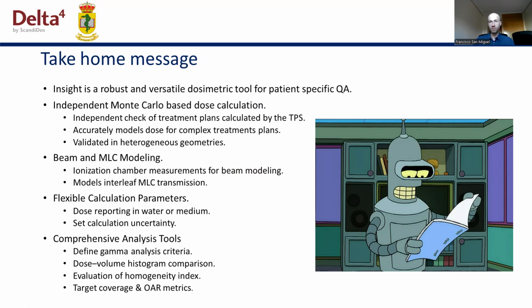Also, again, this is very important for us. Besides, although Insight does not perform fine modeling of the MLC behavior, it does model the interleaf transmission with good results, as we saw. As previously noted, this only produces noticeable discrepancy in highly modulated cases.